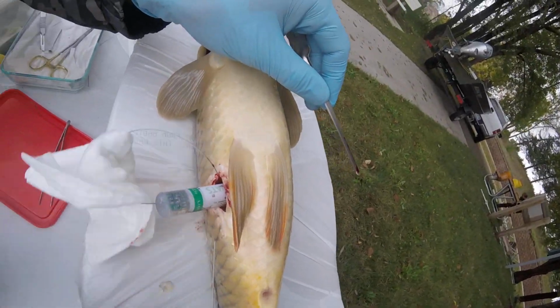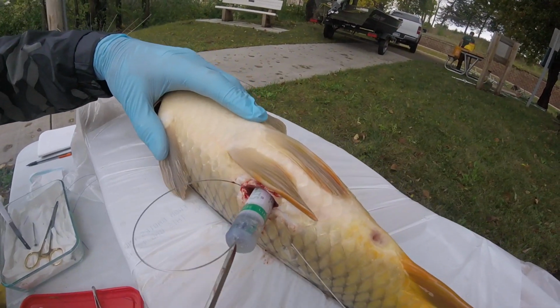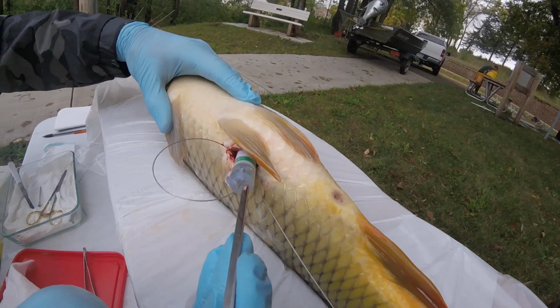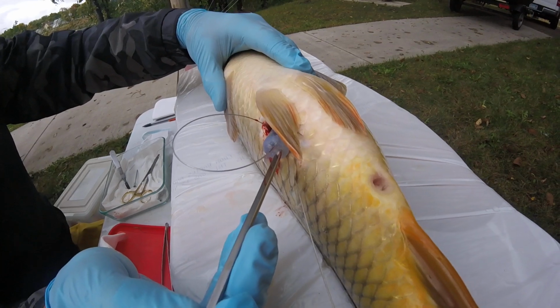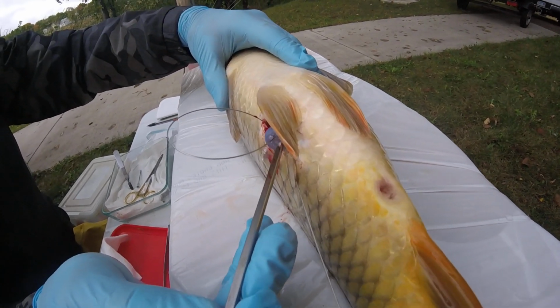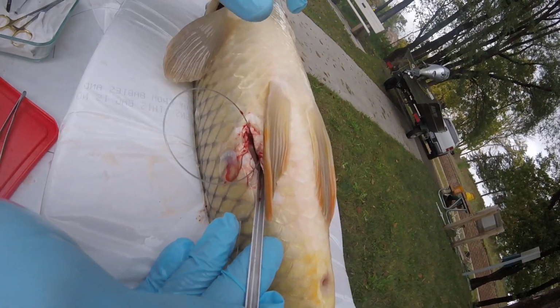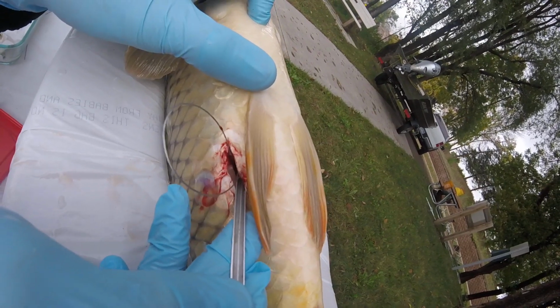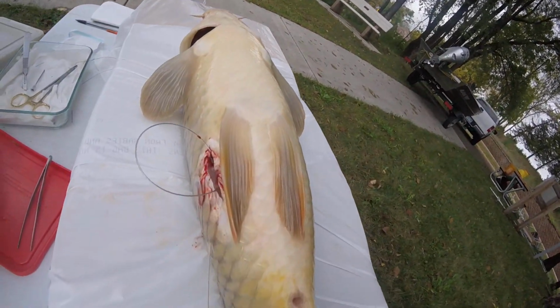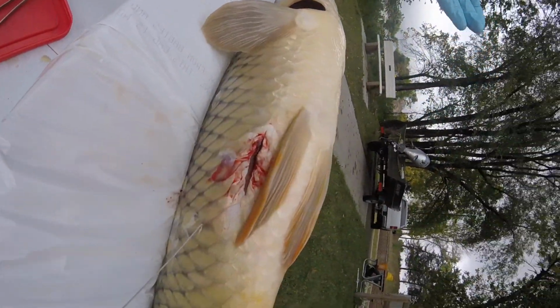There we go. So get that in there. Now we're going to use this to aim it forward, and the tissue in there, there's connective tissue, but you just slowly push it in and then forward up above. So you want it to sit ahead of the incision. So then I've got that placed in there. Now I'm going to untwist this, pull that clean.